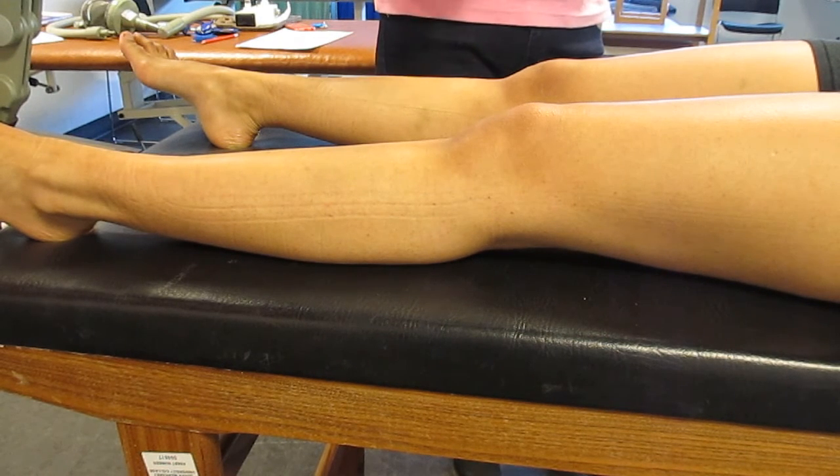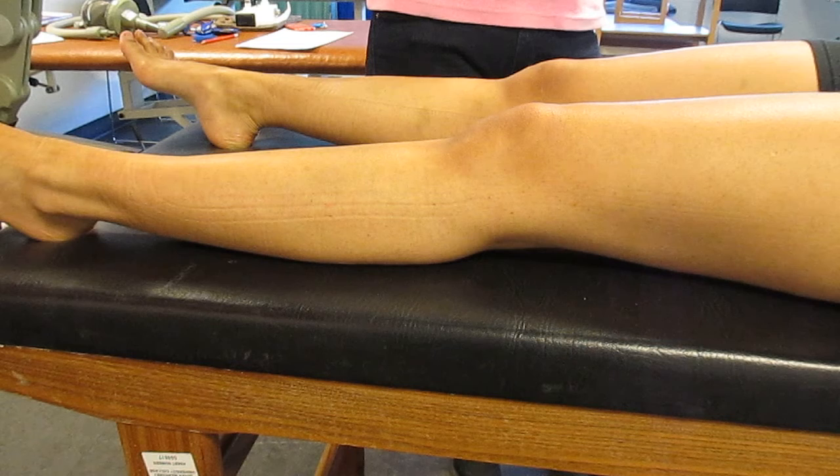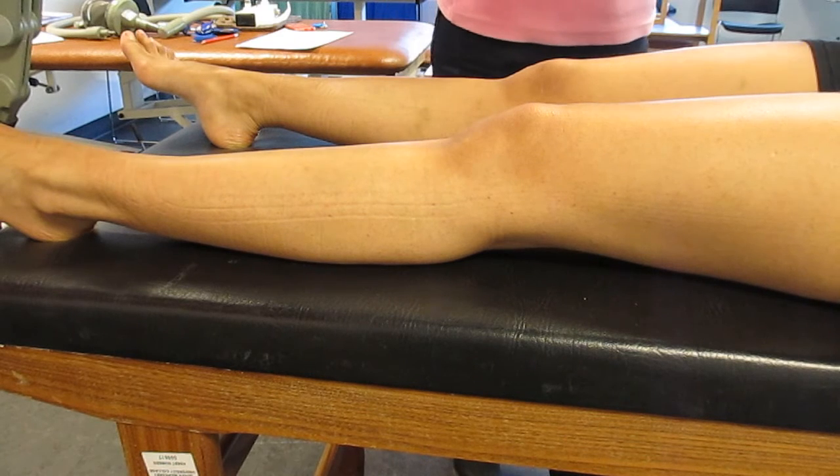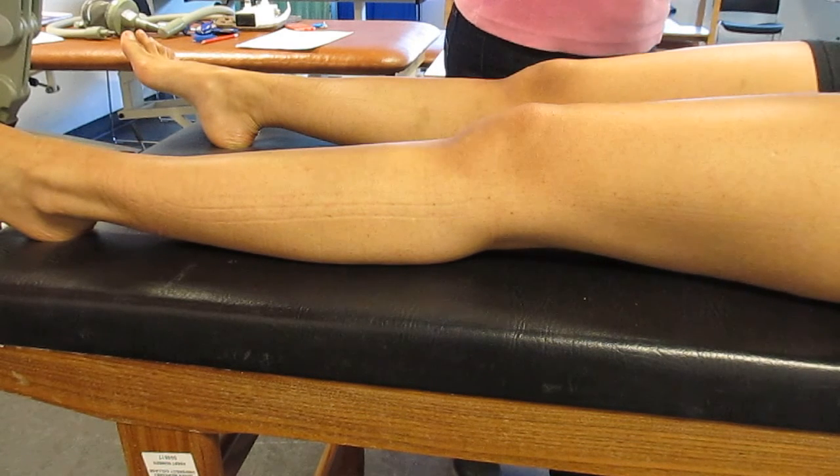You're going to get your patient's consent and you're going to check that they have good skin sensation. Because if you're doing pulsed shortwave therapy, you don't want a thermal effect, but you want your patients to be able to recognise if they do feel any heating. So I've got a hot test tube and a cold test tube here, so just get the patients to feel in their hands — that's hot and that's cold.